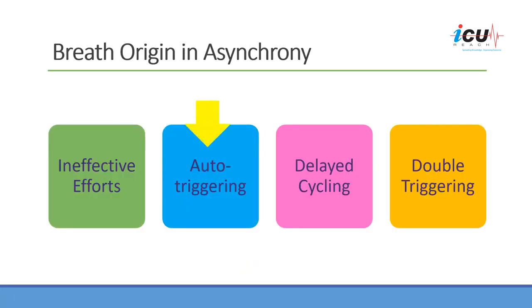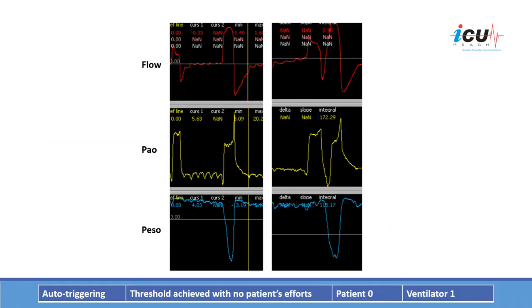The second case is auto triggering. Looking at this graph, you can see that there is no inspiratory effort by the patient, yet there is a ventilator breath. The patient did not trigger the ventilator — it was triggered automatically. You can see a rise in pressure, inspiratory flow, and expiratory flow.